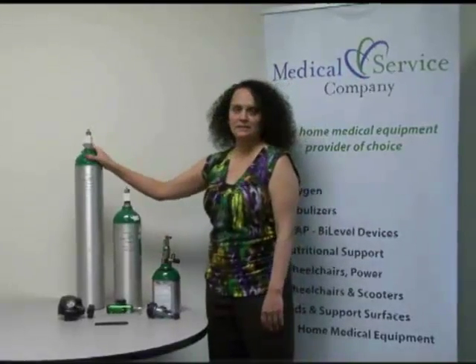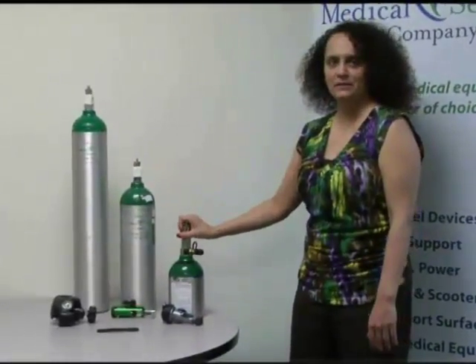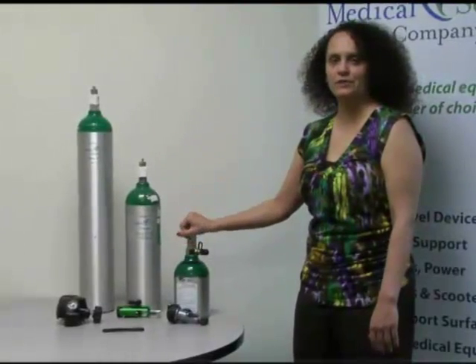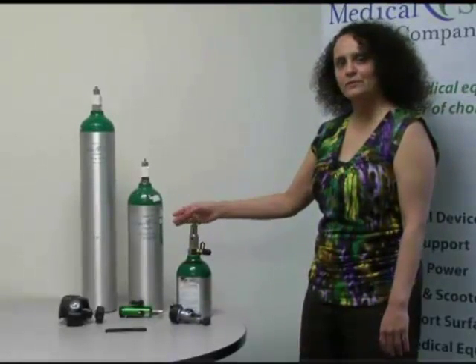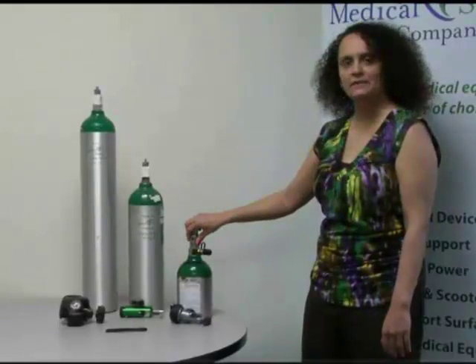This is an E tank, this is a D, and this is a home fill tank. You might get different size tanks in your home depending on what you need and what your doctor has ordered. They're all going to do the same thing — they're all filled with oxygen and all of the gauges go on top exactly the same.